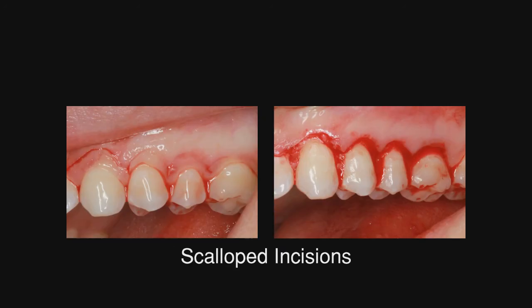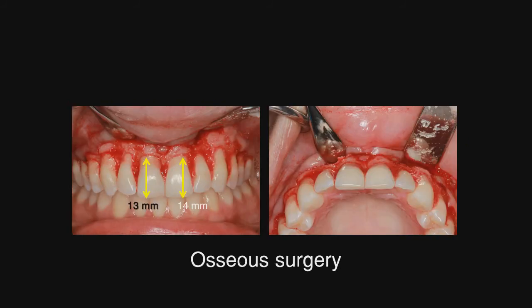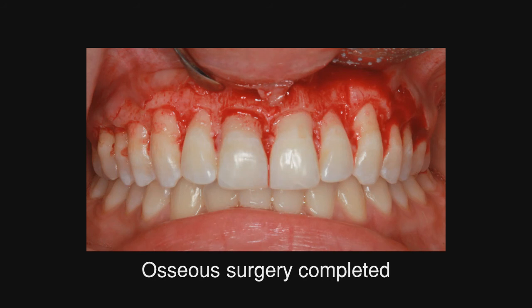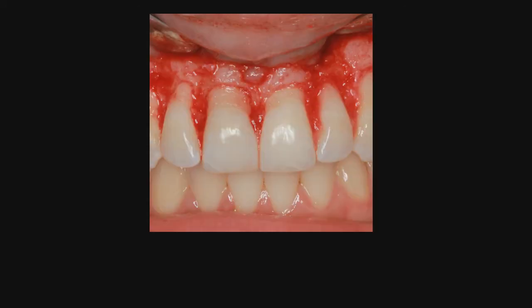So Dr. Mantor went in there and made his scalloped incisions, and when he reflected it, look at the osseous defects that were going to need to be removed. What I would like for you to see now is that after the crown lengthening was done, it was somewhat underdone on tooth number 8, and we're going to follow that through. So here we see the bone level on number 8 is a little thicker and not quite as much was removed. By using Dr. Stephen Chew's crown lengthening gauge, we can avoid that mistake.